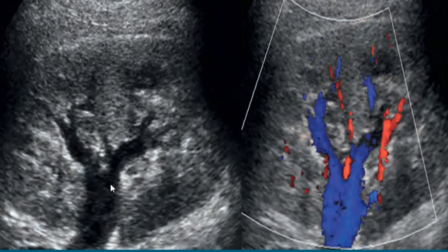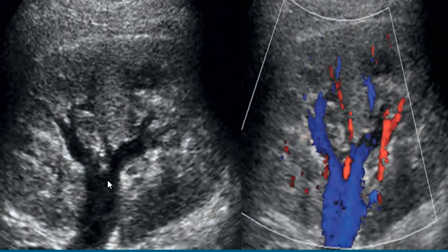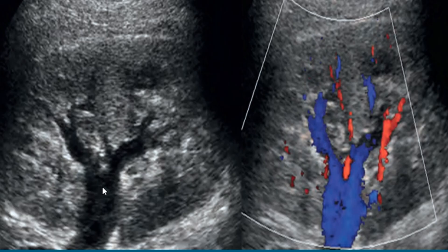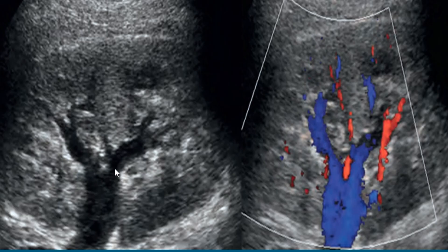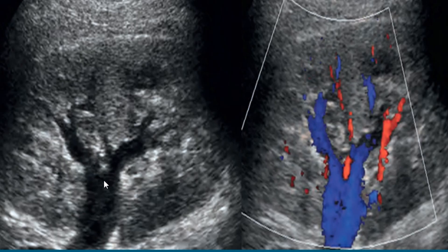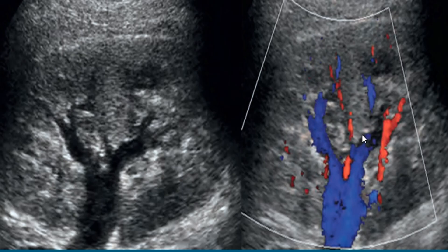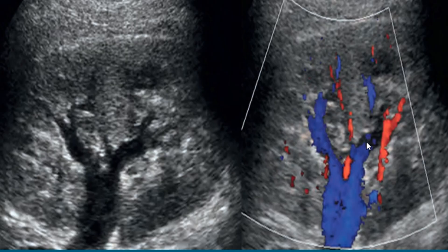This is a very interesting case showing prominent renal veins simulating hydronephrosis. The longitudinal view shows mild separation of the central sinus by anechoic branching structures. Although the branching pattern is slightly different from the collecting system, the appearance can be easily confused with hydronephrosis. The color Doppler view confirms these are prominent vessels rather than the collecting system.